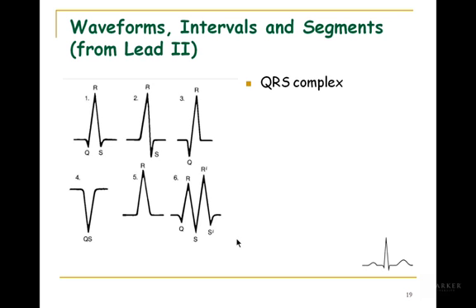If that QRS complex is longer than 0.1 to 0.12 seconds, they call it an incomplete block, and we call it incomplete block within the Purkinje system. If it's greater than 0.12 seconds, they will refer to it as a complete block of conduction within the Purkinje system.